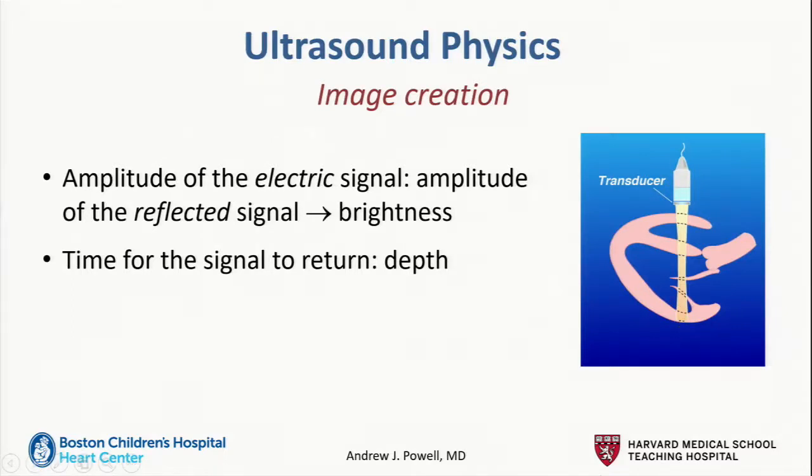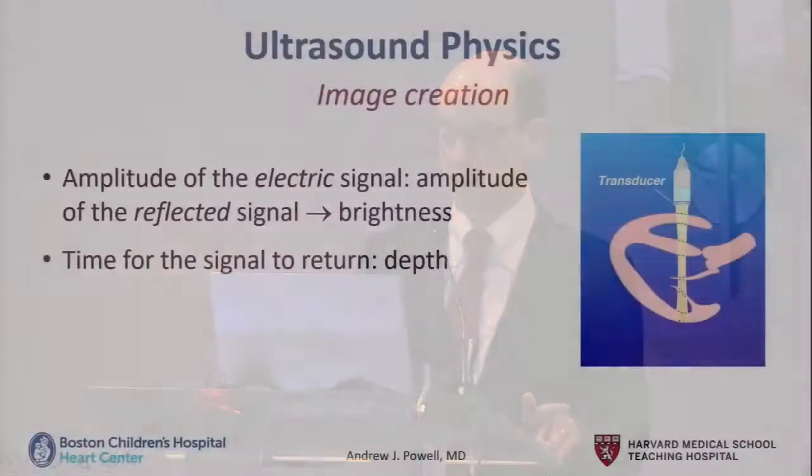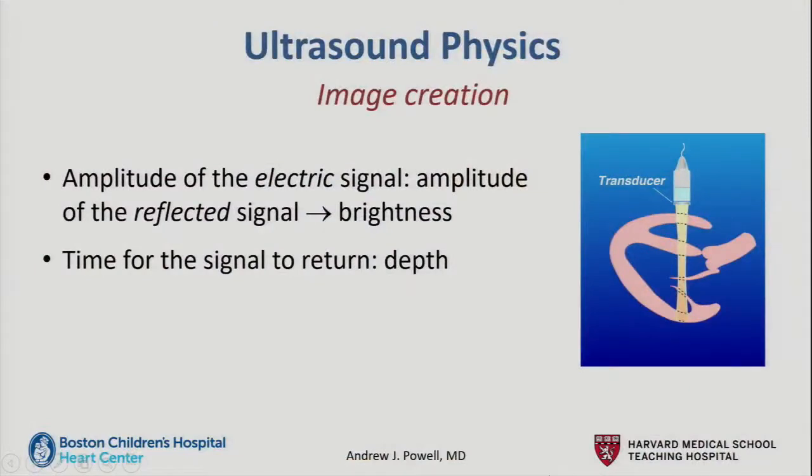In a lot of ways, it's analogous to a thunder and lightning storm. You see the lightning, and if you hear the thunder right away, that means the storm is near. And if you have to wait 1, 2, 3, 4, 5 seconds to hear the sound, that means it's further away. So that's what's happening here. If the sound wave comes back quickly, it knows to map it in the near field, and if it comes back after a longer time, it maps it further away.